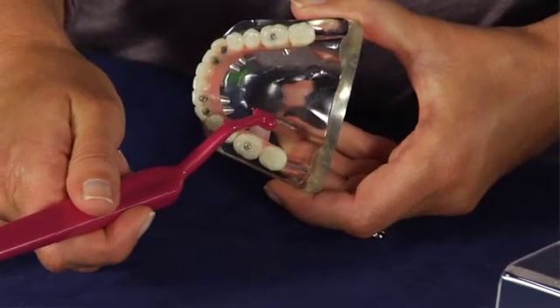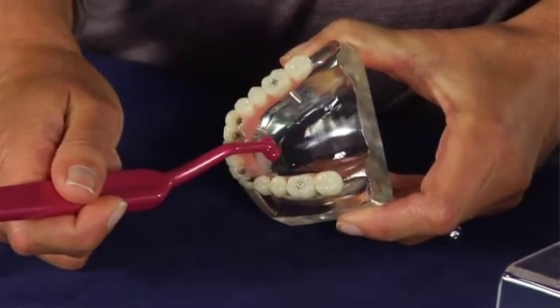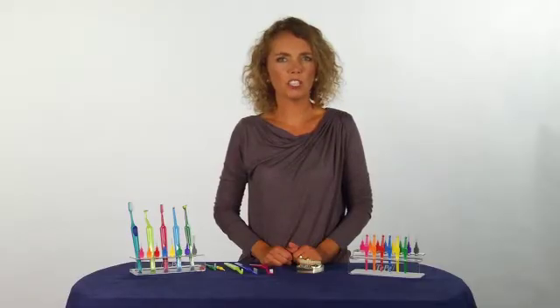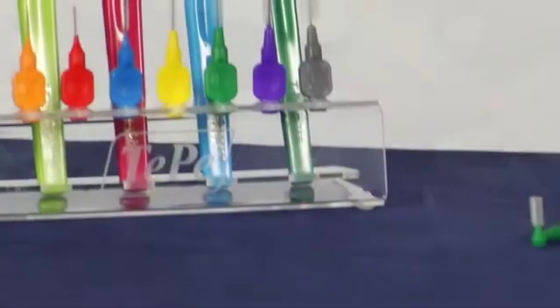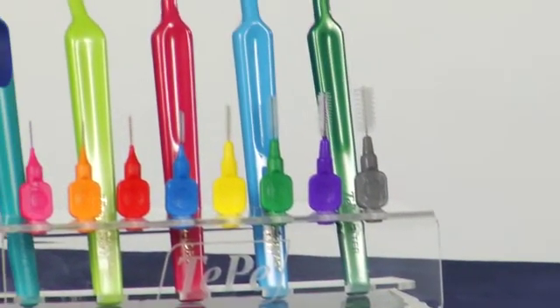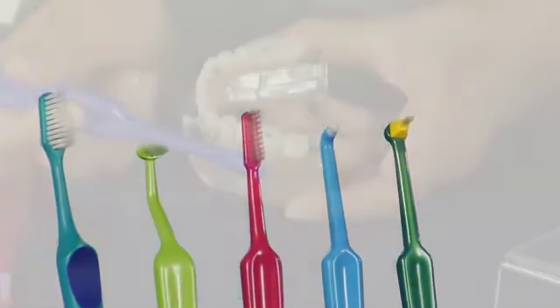Long-term success for implants depends on how well they are taken care of. It's important to remember that implants need to be cleaned at least as well as regular teeth. With proper home care and professional maintenance, dental implants can last for a lifetime. Special cleaning devices are often needed, and TePe offers a variety of brushes to make daily oral hygiene easy.